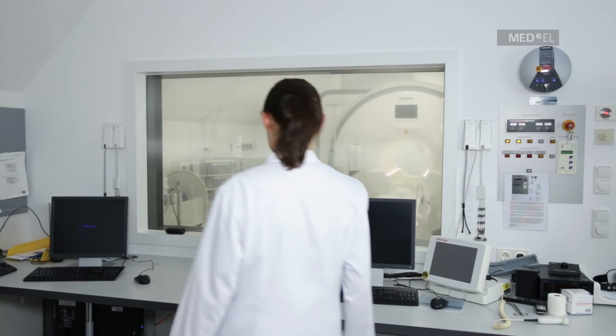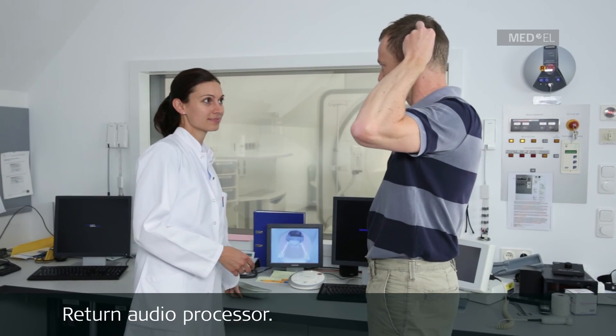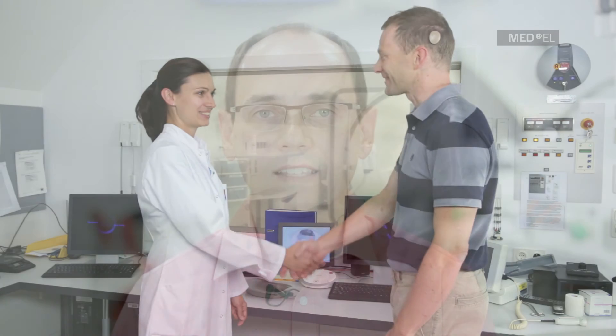After the MRI examination, the patient should put on their audio processor only after leaving the MRI room. By following these basic conditions, you can safely MRI scan patients with the Vibrant SoundBridge Warp 503 middle ear implant system. Please contact your local medical representative if you have further questions.